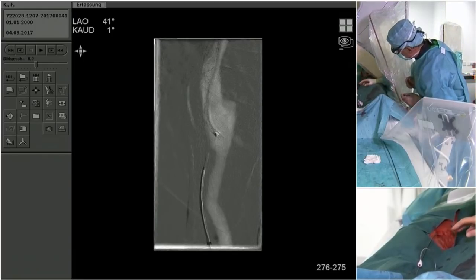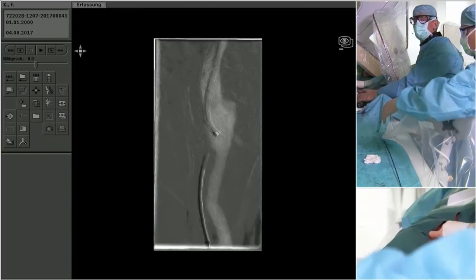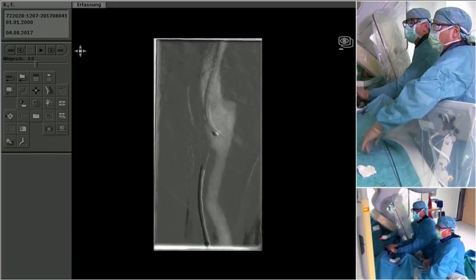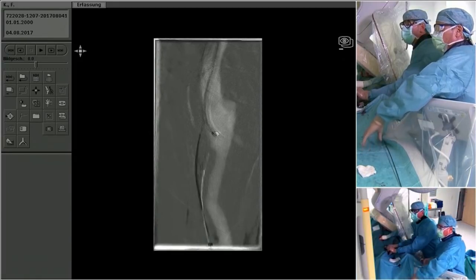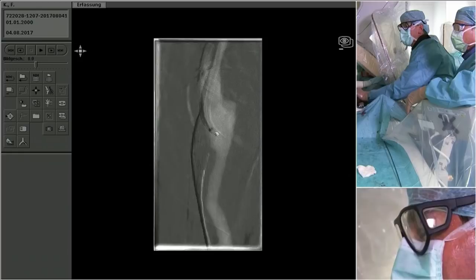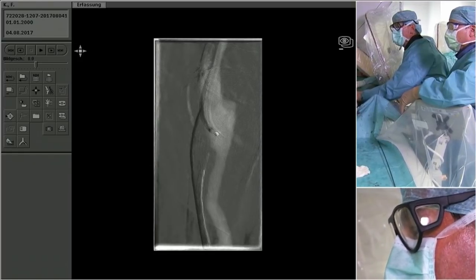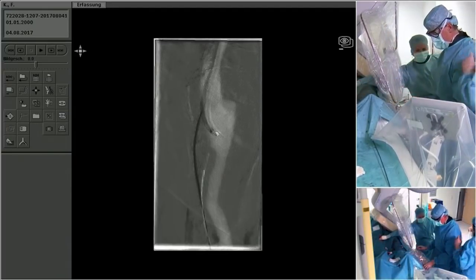Yeah, now you need 4 hands. And now I try to push once again that needle high up. But you can see it now. It's jumping away here from that proximal end. So this is an access a little higher in. If it can access here.